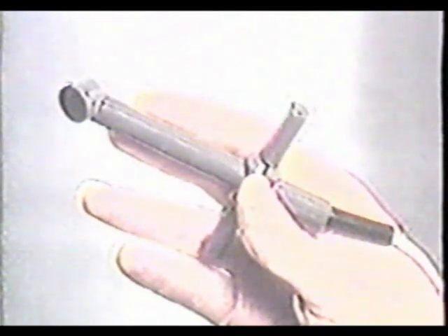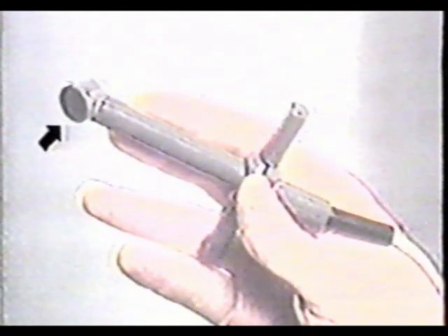The continuous wave examination of the stenotic mitral valve can also be performed by placing the non-imaging probe at the apex. The small tip fits nicely between the ribs and yields a very crisp spectrum.